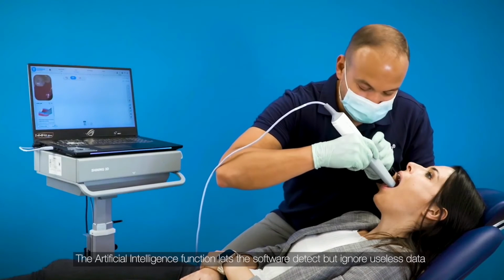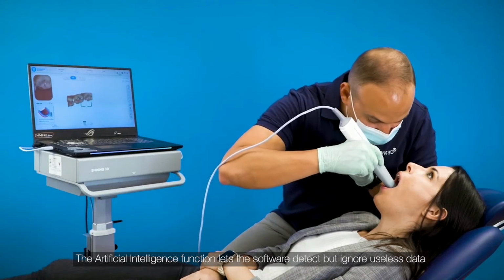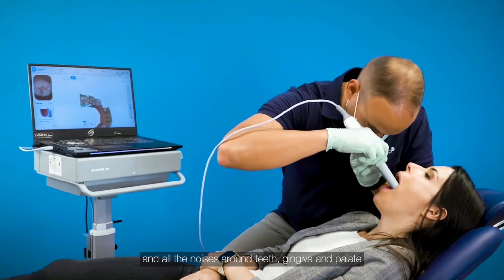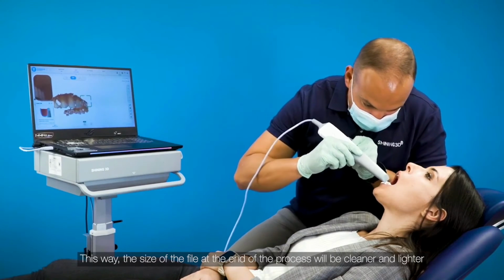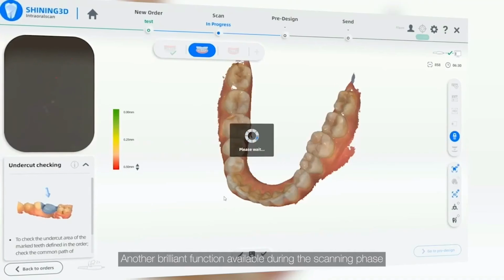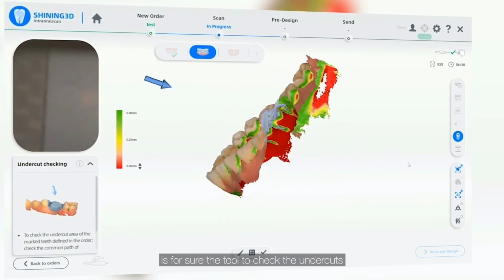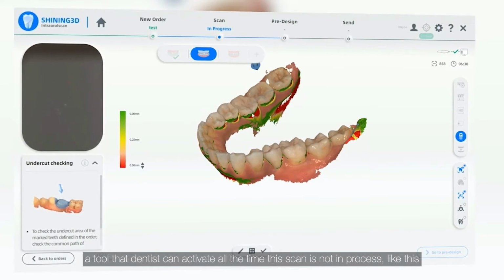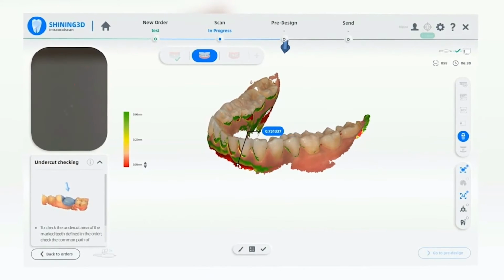The artificial intelligence function lets the software detect but ignore useless data such as tongue, cheeks, dentist's fingers, and all the noise around the teeth, gingiva, and palate. This way, the size of the file at the end of the process will be cleaner and lighter. Another brilliant function available during the scanning phase is for sure the tool to check the undercuts, a tool that dentists can activate any time the scan is not in process, like this.